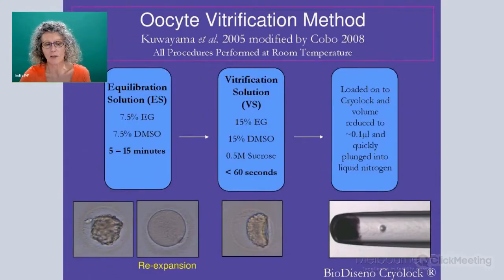So let's look at their procedure. You can see initially when we place the oocyte into the equilibration solution that it shrinks down in size and the water starts to move out very quickly out of the oocyte. Then it re-expands and it comes back to about 80% of its initial volume. At this stage they then moved the oocyte, as soon as it had re-expanded, into the VS solution, and they left it in the VS solution for less than 60 seconds. They then loaded it on the cryolock with a minimum volume of around 0.1 of a microlitre.